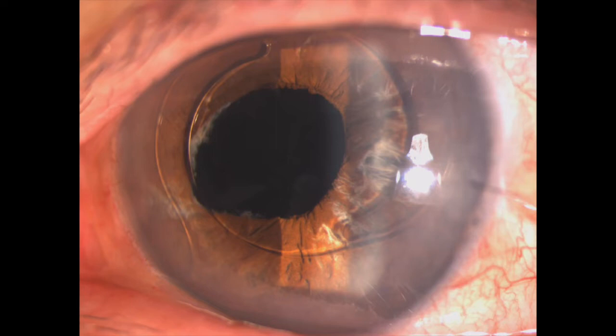This is a physician with glare and monocular diplopia from an anterior chamber lens. The pupil is distorted and extends beyond the optic, causing his glare. Gonioscopy demonstrates that the nasal haptic is fibrous within a cocoon of iris and will be very difficult to dissect out.